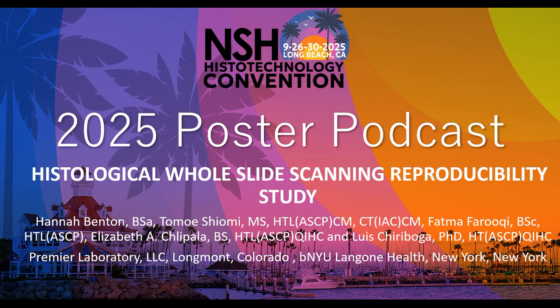Yeah, but it certainly has relevance for the clinical laboratory if they start using image analysis for analyzing slides, right? From the time of sectioning to the time of scanning, there potentially could be an issue, or how many times it's scanned.